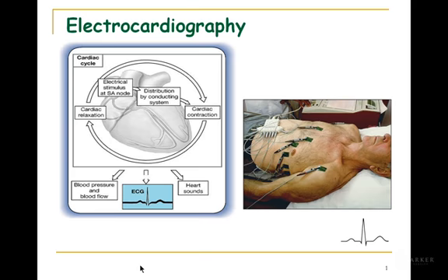What we're going to get when we use an ECG is we're looking at voltage gradients that are created as myocardial cells sequentially depolarize and repolarize, that are the electrical activity created by this. It's transmitted up to the body surface where we attach these surface electrodes, which is then attached to a machine, and we can record this.